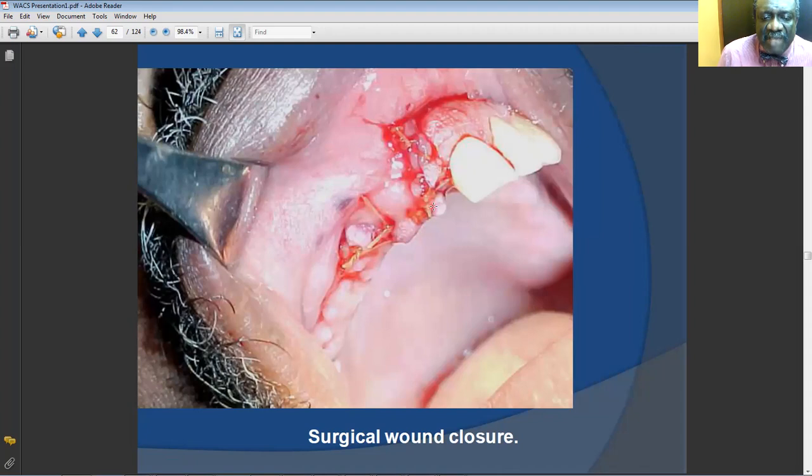After you close up, the pressure will want to let itself out, and you're going to end up with exfoliation of the implant. And this is pathologic exfoliation.